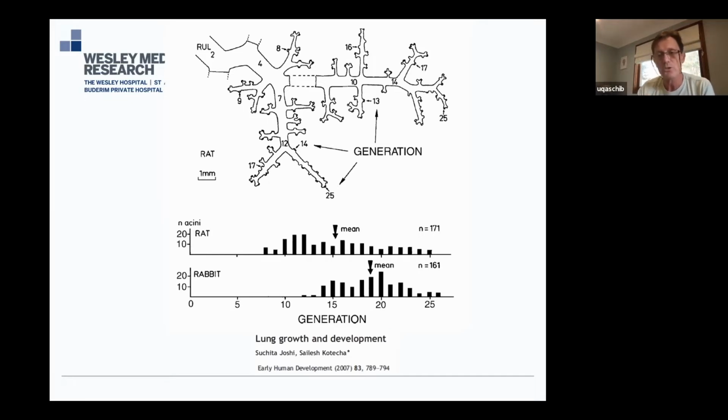That's why it's not surprising that adults are not benefiting as much from high-frequency oscillation compared to neonates. And if someone is game enough to look at ventilation distribution in an elephant, I would be very sure that high-frequency oscillation, as we do it, is probably not working at all.